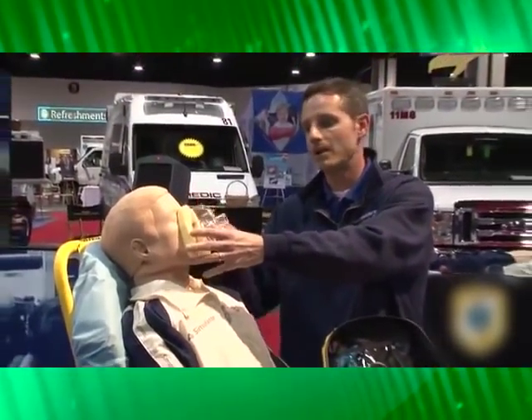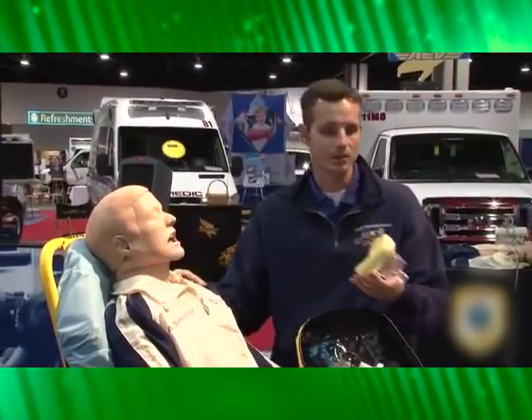The mask will be applied higher on the face so that you get a nice good seal, because you want to prevent leaks. When you're creating CPAP for the patient, you're increasing pressure within the airway, and you want to make sure that you don't have leaks around the face.